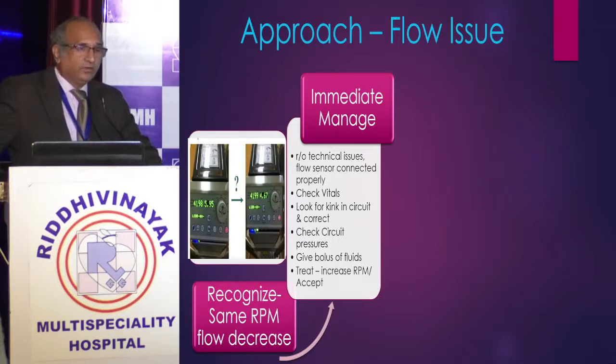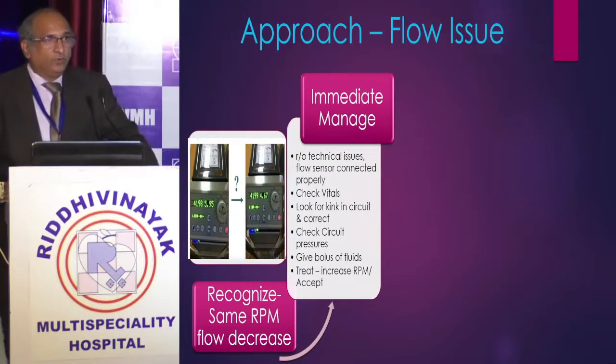And whether to treat it or not, or whether to accept it, that is important. What has gone down is your flow. With the flow going down, you can have a drop in saturation or a drop in blood pressure also, if it is VV ECMO or VA ECMO. Now, does this decrease in the flow require treatment?